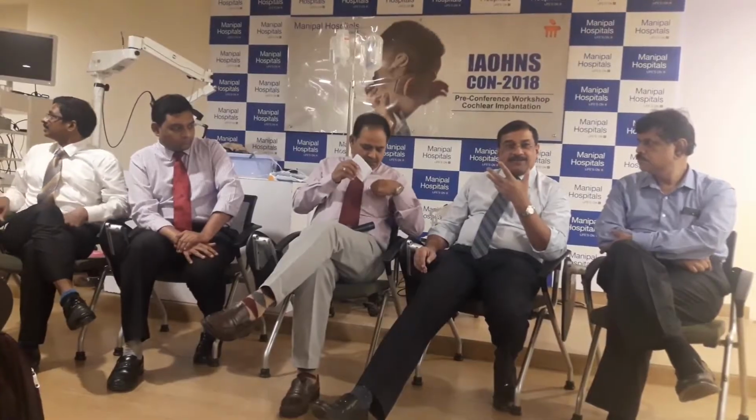Unlike in meningitis, where mostly it's the basal turn, here the basal turn is involved, but the second turn can also be involved. So you may have difficulties with insertion. The bigger problem is electrical leakage from the bone. The otosclerotic bone is very porous for electricity, so a lot of patients will have stimulation outside the cochlea, and you may have to identify them.